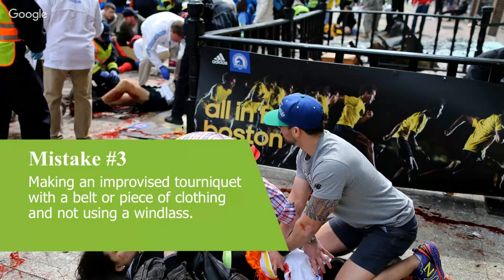So Matt O'Shea has asked our thoughts on the SWAT-T tourniquet. I haven't got a great deal of experience with the SWAT-T itself, Matt, but I've used similar Esmarch type bandages. Esmarch type bandages have been used for close to 100 years, and the SWAT-T is very similar to an Esmarch bandage. It has its limitations: you're unraveling a rubber tape, essentially. So if your hands are covered in blood, it can be slippery. If it's wet, or if it completely unravels out of its roll, they're very difficult to apply.